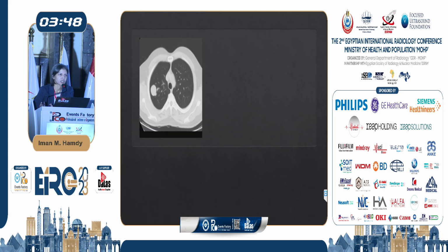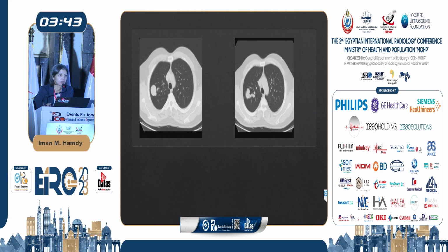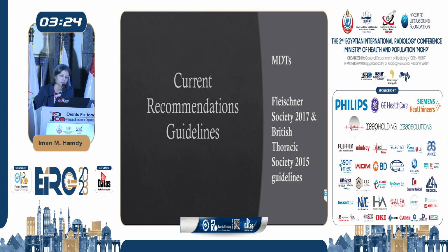And before leaving the possibilities, we have always to put in mind that vascular nature should be in our mind to avoid unnecessary intervention. In case we suspect that there is a feeding vessel or any lobulated outline that could be vascular, we have to proceed to post-contrast or further investigations before going to an invasive one. All the decision-making of whether this needs follow-up or not should be a shared decision in an MDT between the radiologist and the clinician.